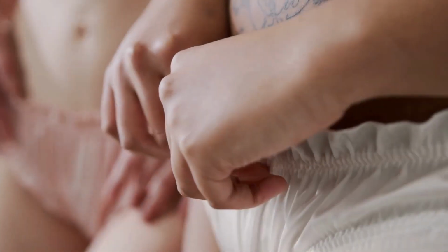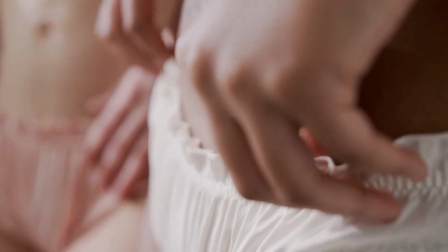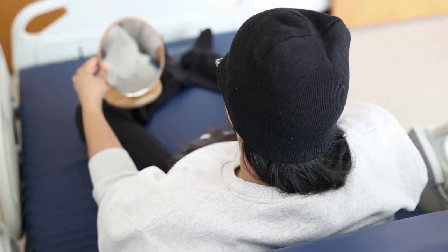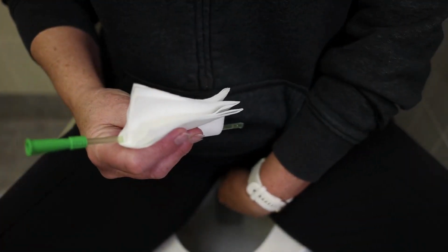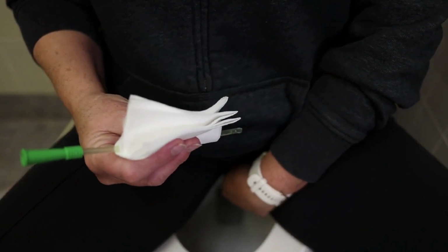In this video series, we will learn about the female pelvic anatomy and how to self-catheterize in a variety of positions and settings. Before attempting self-catheterization, it is important to familiarize yourself with your own pelvic anatomy. Familiarizing yourself with your anatomy allows you to visualize where the catheter will be inserted. Knowing the appearance of the labia and the location of the urethral opening ensures proper catheter insertion with minimal hassle.